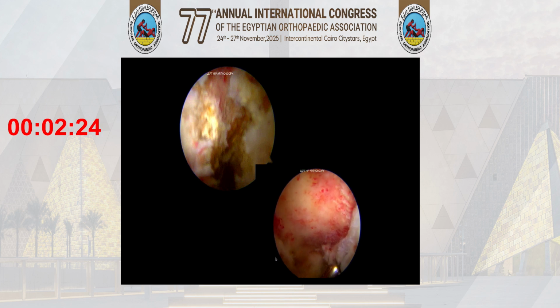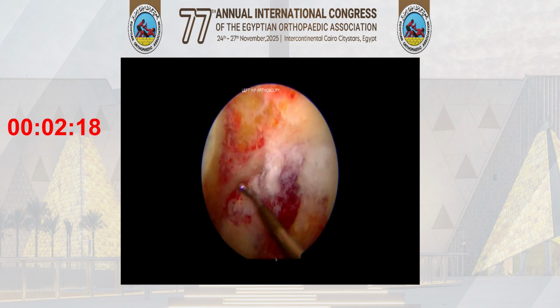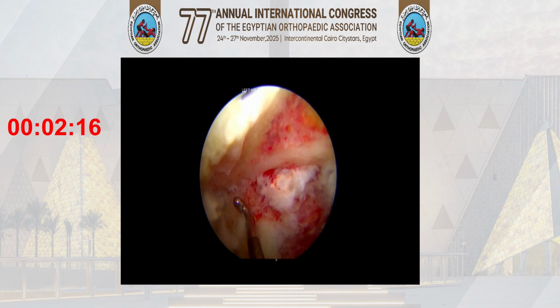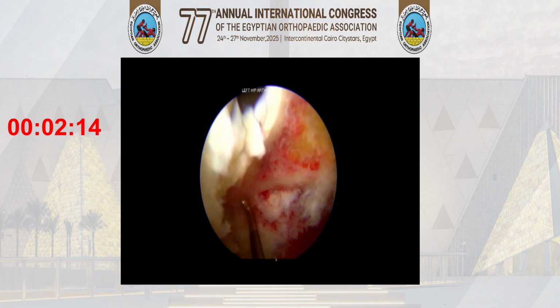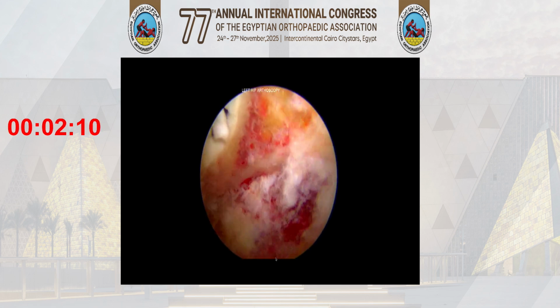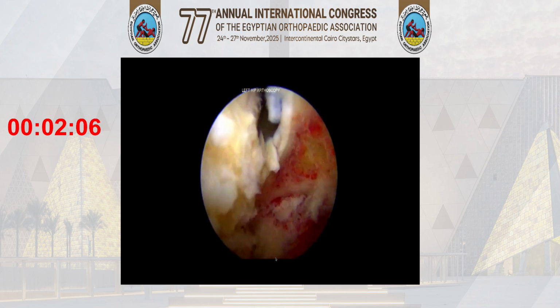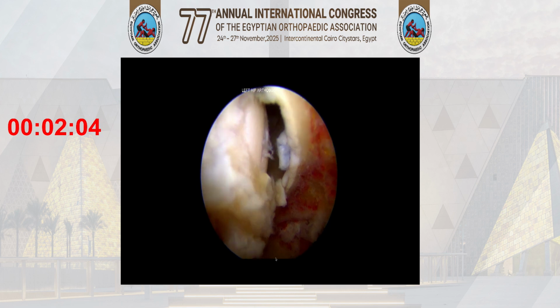On the left side is the neck after removing of the cam and the bump. This is the final resection. We start measuring this. We use the actual suture to measure the distance to plan our labral reconstruction and the length of the graft. You fix it to one point, you make a mark, you go to the other point, and you measure the distance on the suture.